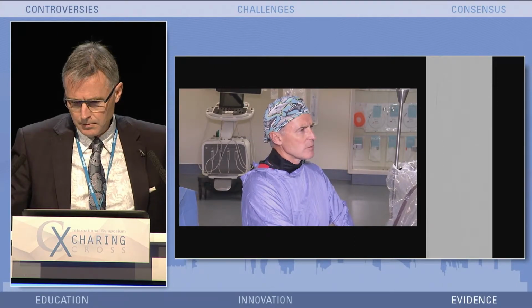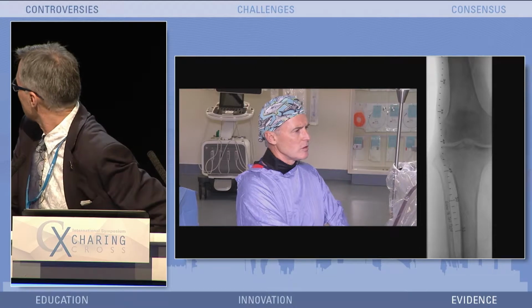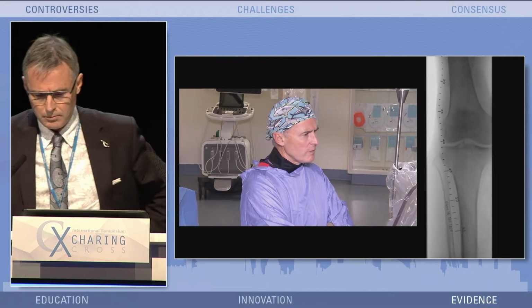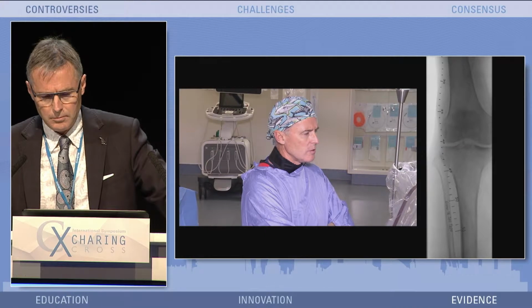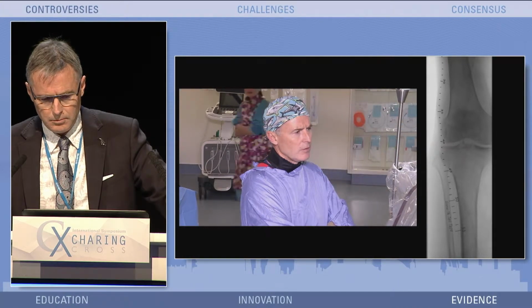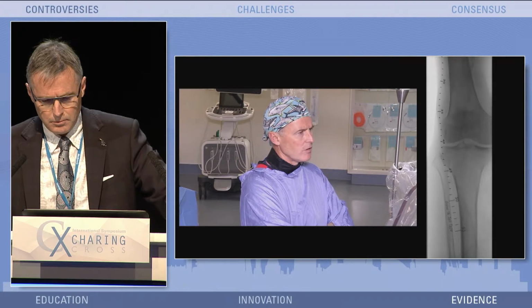Now we can just unsubtract that, thanks, and you can see that calcium again through P1, P2 and into P3. And around about the ruler, around about the 50 or 55 mark, you can see the typical medial calcification that we see in a long-standing diabetic and chronic renal failure patient such as this one. You can see that extensive medial calcification in the tibial artery.